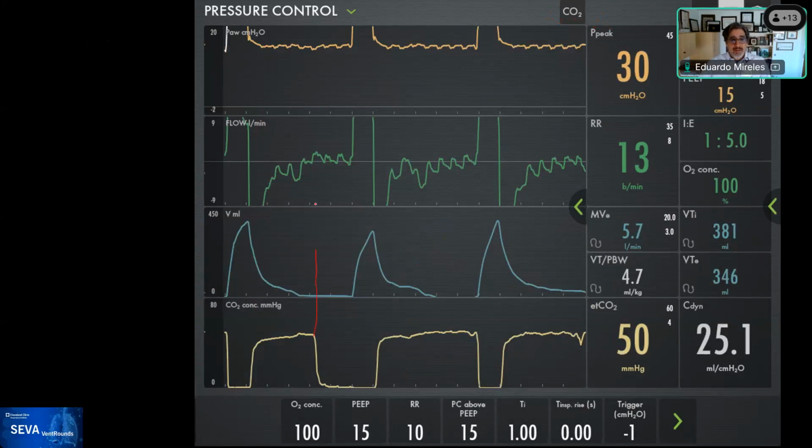You can see that the patient still is doing effort, very mild, but enough to create inhalation, and sometimes the breath is machine trigger. There's an attempt to fail here. You can see that little thing that I demonstrated before. So what's the solution for this patient? How would we solve this? I have tried every single type of trigger, and it causes more problems than solutions, right?